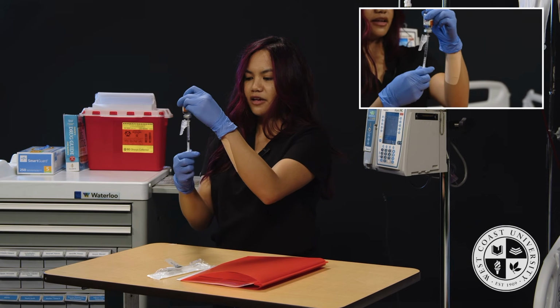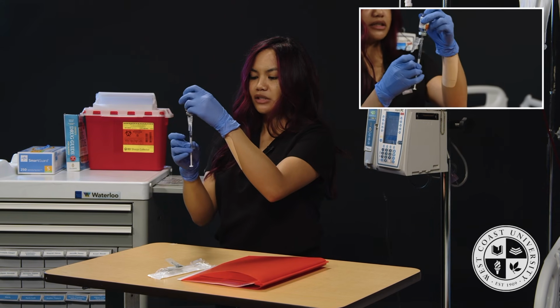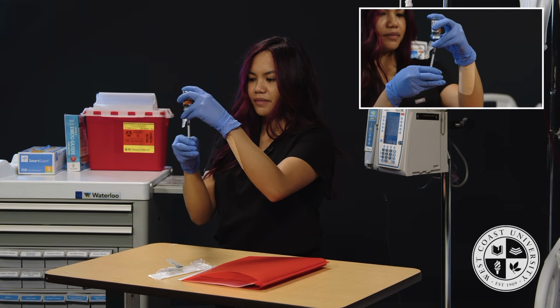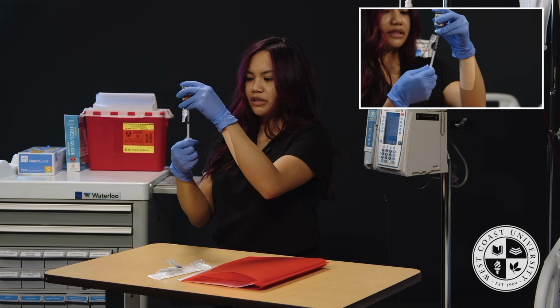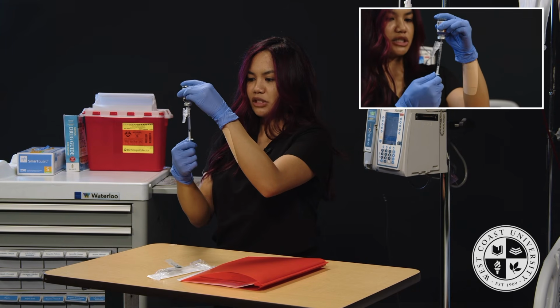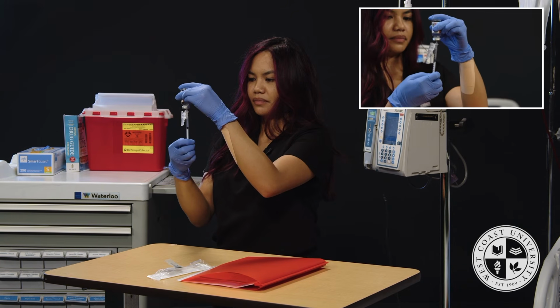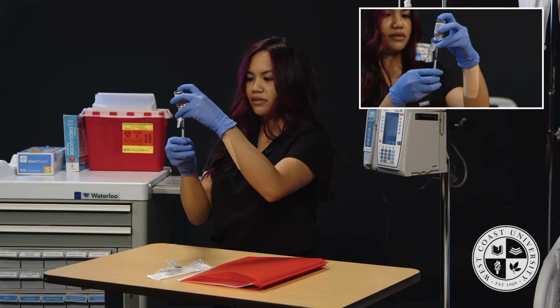Again, we are facing air bubbles, which is okay as long as you get them out prior to inserting it into your patient. Okay. And this is going to be a single dose vial because most heparin doses for a subcutaneous injection is going to be a single dose vial. Meaning this vial is going to only be used once for one patient.